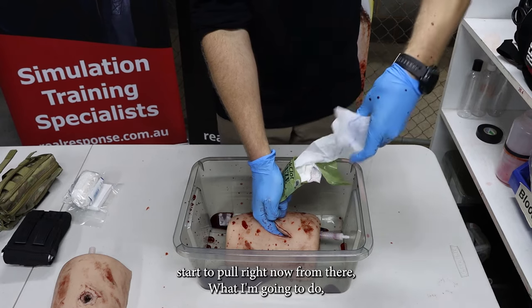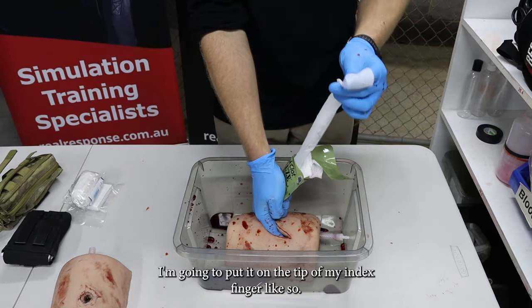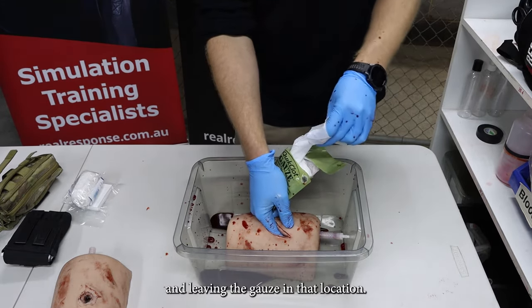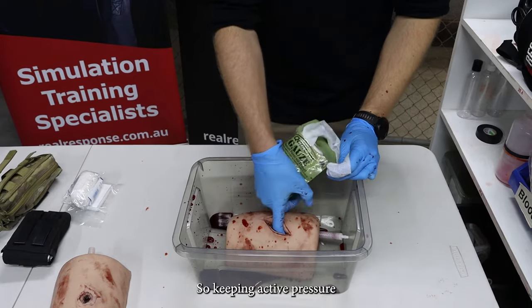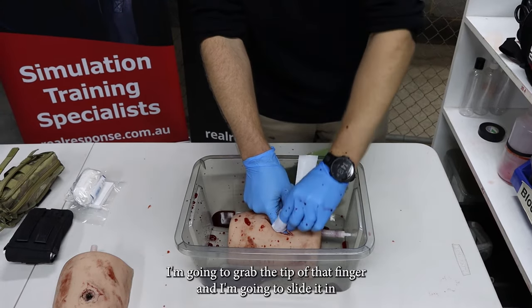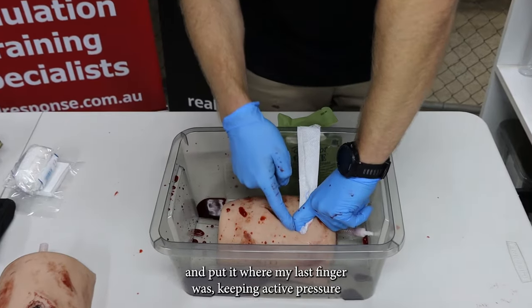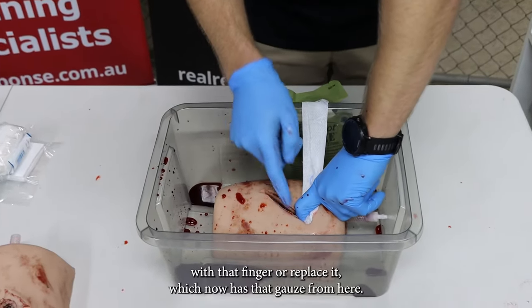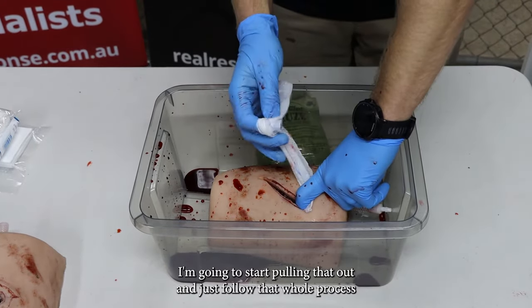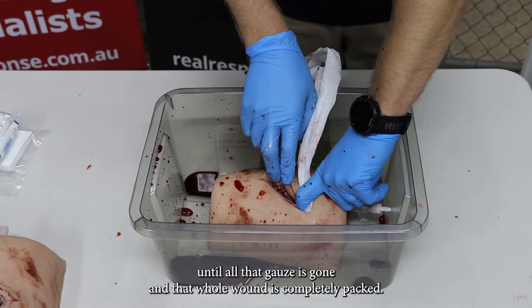What I'm going to do is put it on the tip of my index finger like so and start replacing my fingers, leaving the gauze in that location. Keeping active pressure on here, I'm going to grab the tip of that finger and slide it in, putting it where my last finger was. Keeping active pressure with that finger, I've replaced it which now has that gauze. From here I'm going to start pulling that out and just follow that whole process until all that gauze is gone and that whole wound is completely packed.